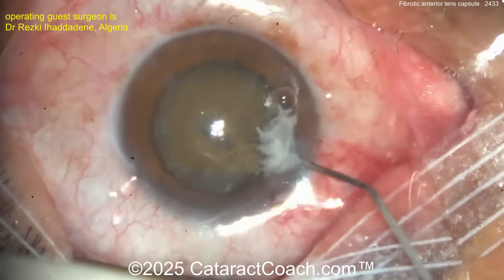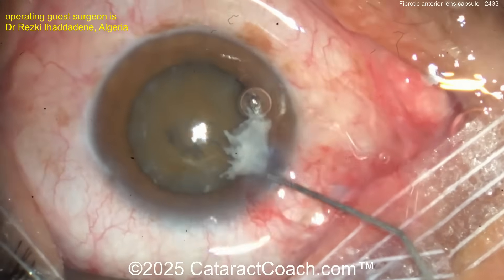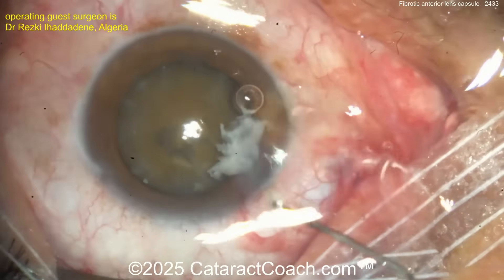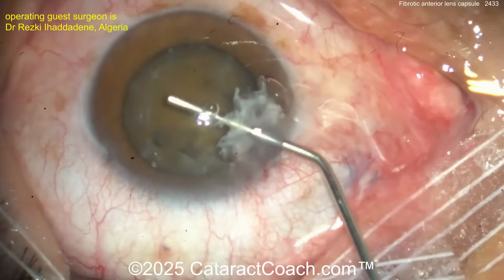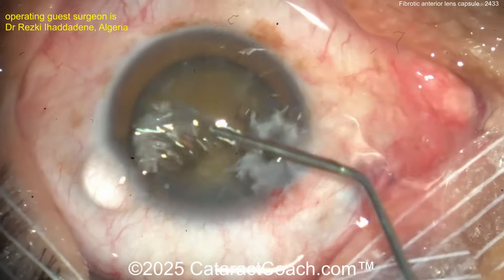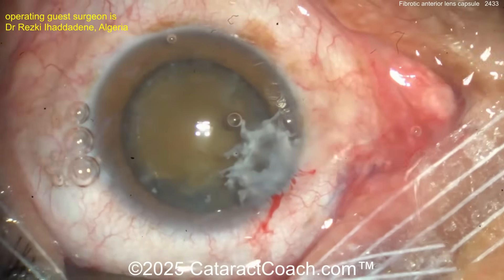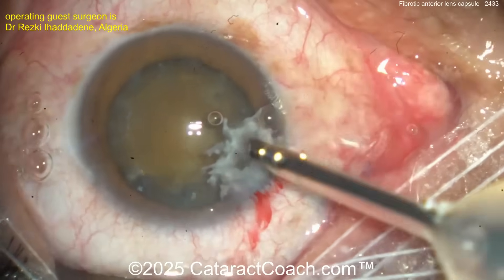Now a little bit of hydrodissection. It's definitely brunescent. Zonules appear to have reasonable support — doesn't look like too much zonulopathy. I'd just grab that fibrotic remnant with forceps and kind of yank it out. I like the viscoelastic, but just grab that thing — don't leave it there.